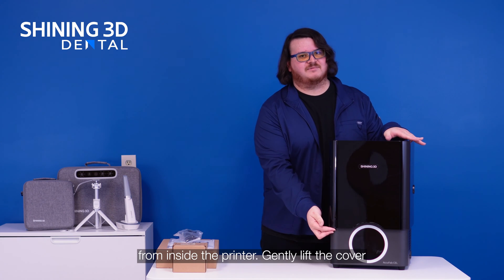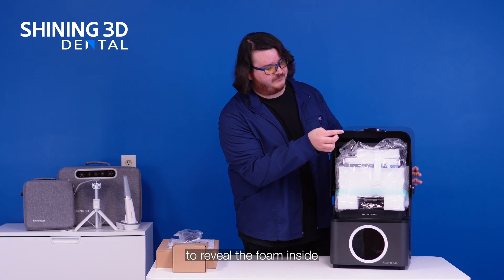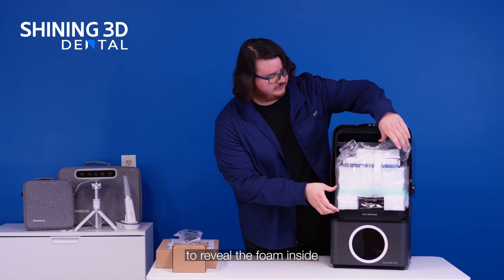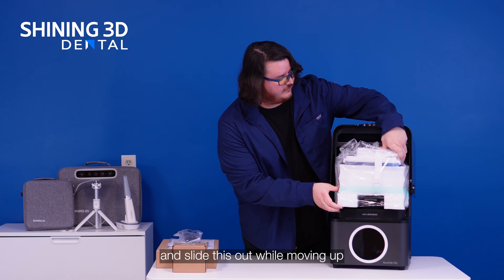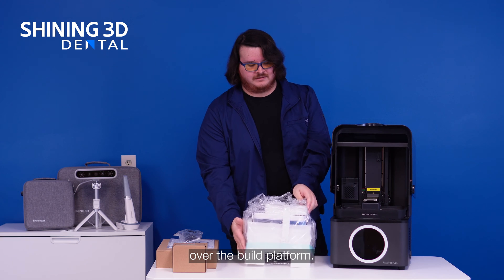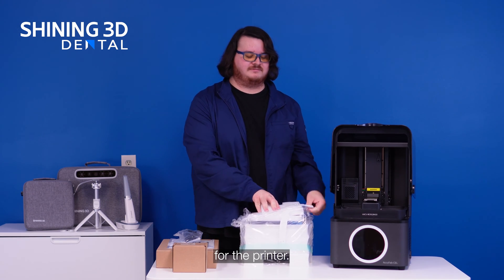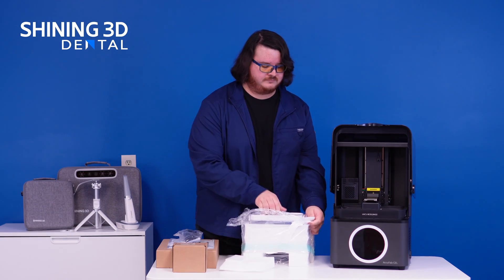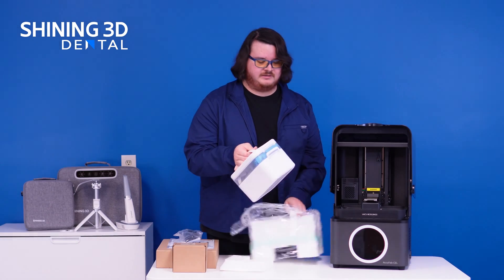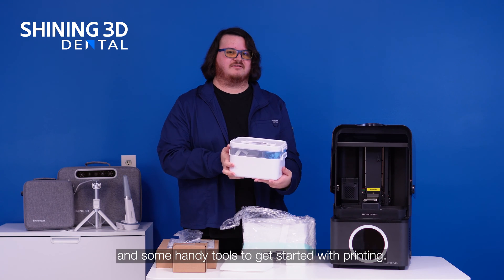Next, we remove the packaging from inside the printer. Gently lift the cover to reveal the foam inside, and slide this out while moving up over the build platform. In this packaging will be our toolkit for the printer, which will include the USB with the printer's profile and some handy tools to get started with printing.